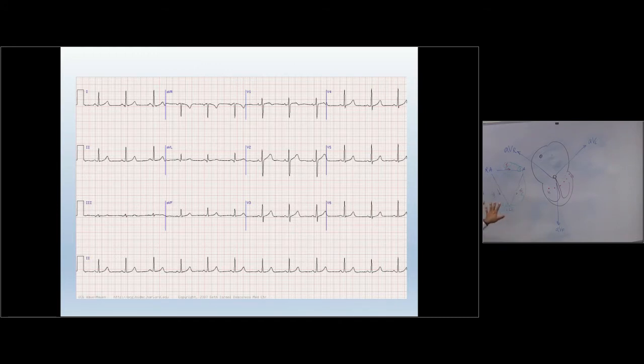Now to apply the Einthoven triangle onto the heart, you can't use this triangle exactly the same way, but what we are going to do is disintegrate the triangle, while at the same time we have to keep the direction of the electricity the same. All right? So we'll take lead 1, so its electrical direction is that way, right arm to left arm.